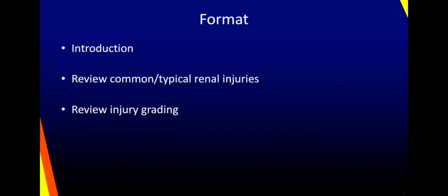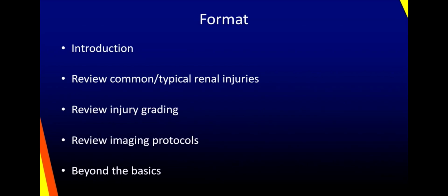We'll start with renal trauma. The format of this portion of the talk is as follows. We'll start with a brief introduction, review some common and typical renal injuries, review injury grading, review imaging protocols, and then we'll go a little bit beyond the basics.